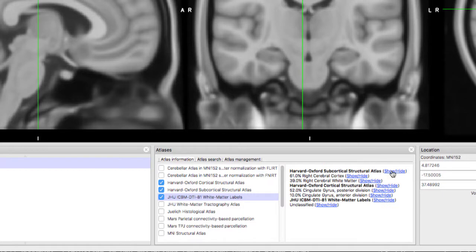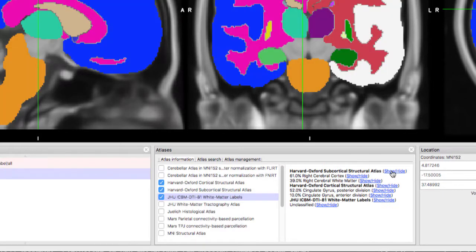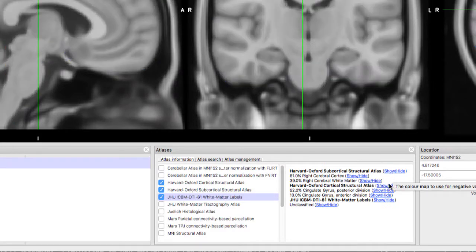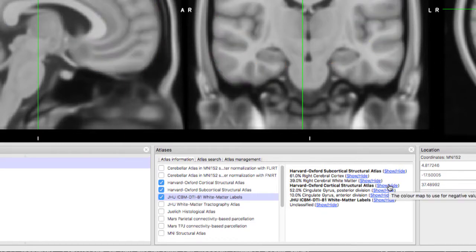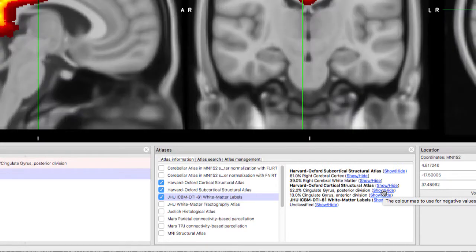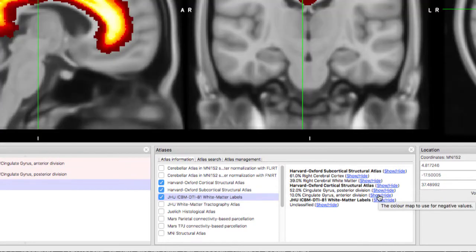You can display the entire atlas by clicking the Show Hide button. Clicking it again will hide the atlas colors. Clicking on the Show Hide button for an individual label will display only that region.